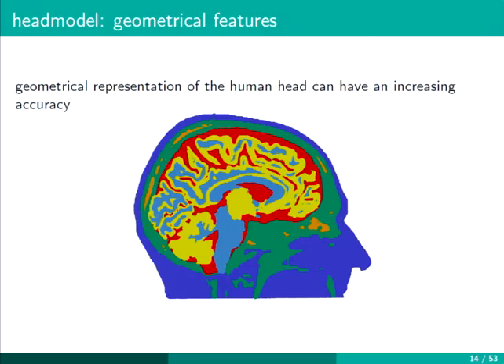Within FieldTrip, yes. Okay, thanks. For the first question, T1 and T2 can be analyzed in FieldTrip, and you can play with some masks to isolate the skull from a T2, and also some erosion procedure to isolate, in this case, the spongy part. So everything was done within FieldTrip.